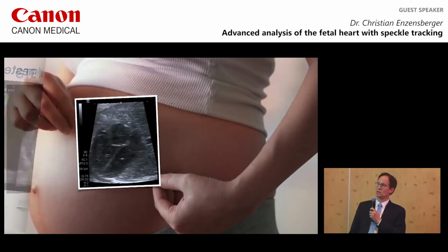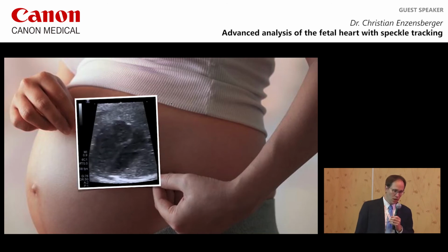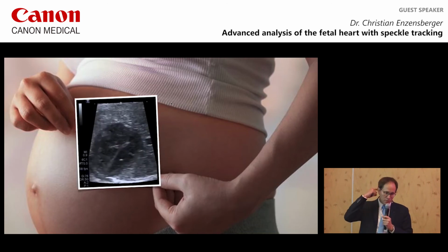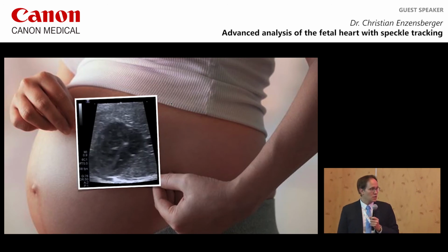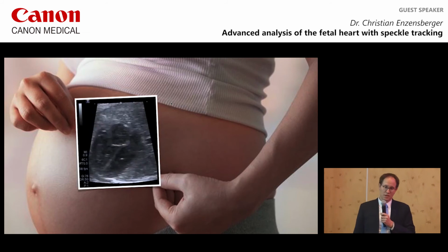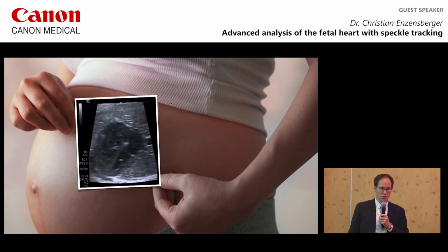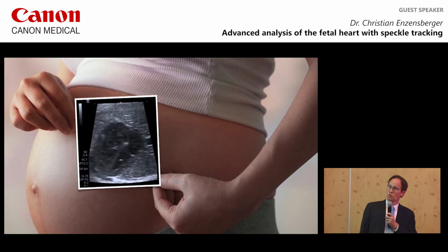I would like to come back to my first slide. Regarding the aspect of fetal programming and cardiac remodeling, fetal cardiac function should be investigated in certain fetal or maternal pathologies. I think it's a very promising tool.